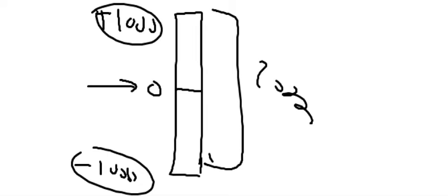So now, everything else is in between. The liver, kidney, the fat, lymph nodes, everything else is in between these two, plus 1000 and minus 1000.